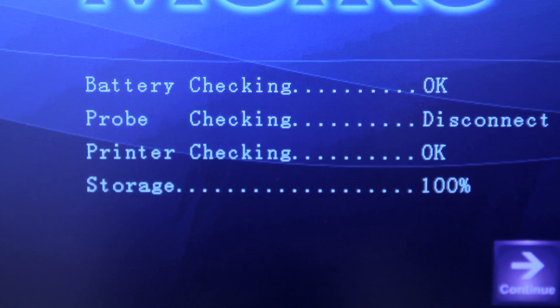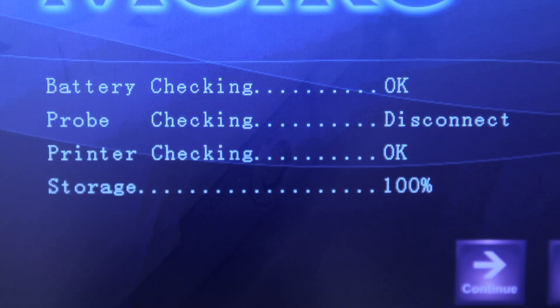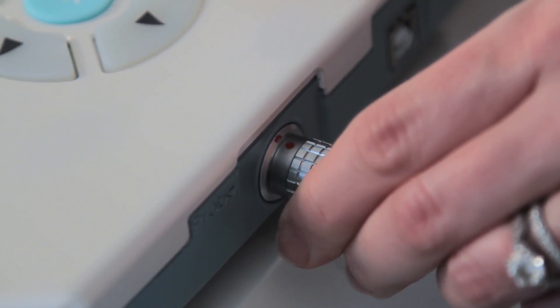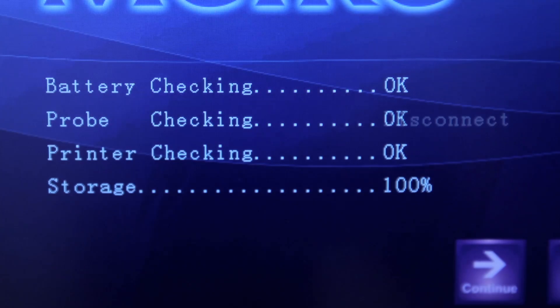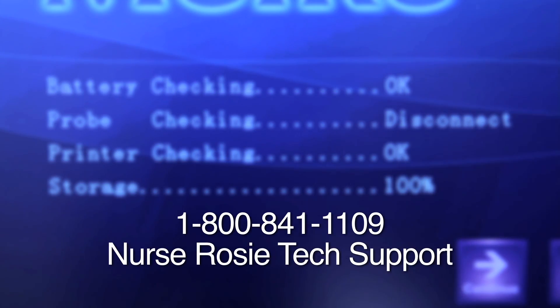If 'Disconnect' is displayed instead of 'OK', check to make sure you have installed the item properly. Self-check will display OK once the connection is corrected. If 'Disconnect' still is displayed, contact Nurse Rosy Products Tech Support.